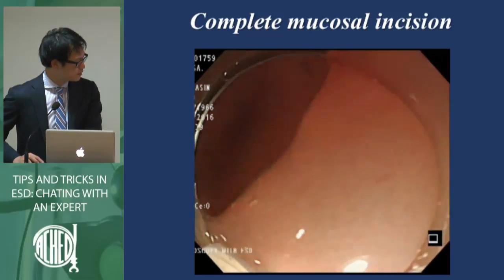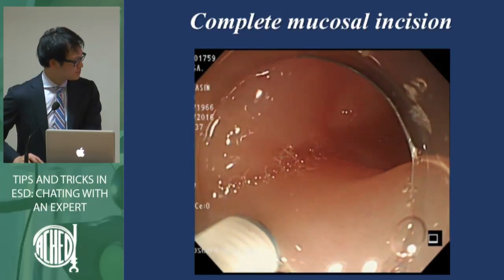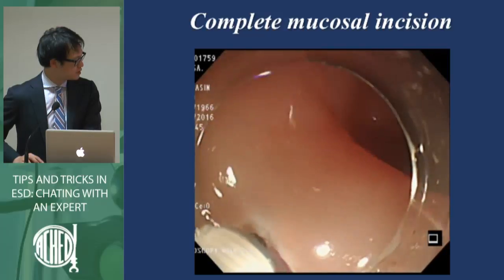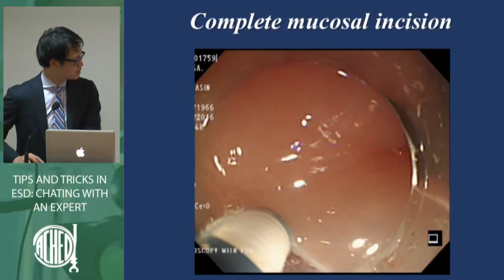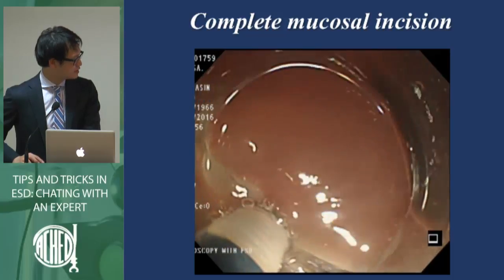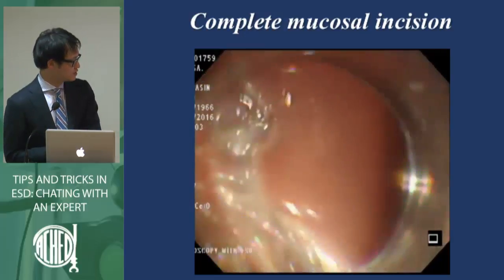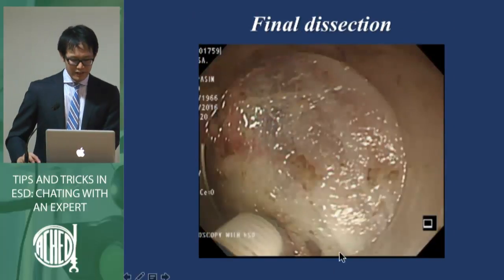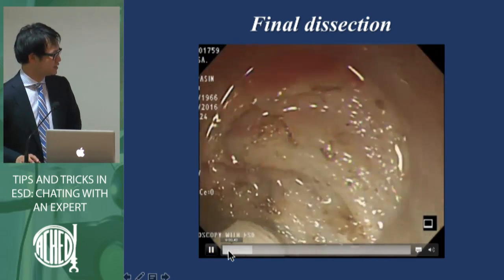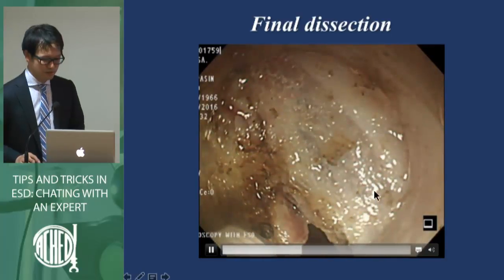You can see it connect to the circumferential incisions. So finally, with the forward view, cutting the some submucosal layers, and then we finish the procedure.